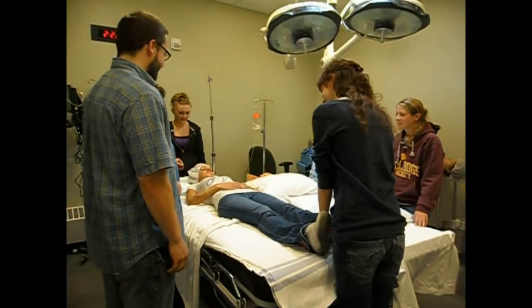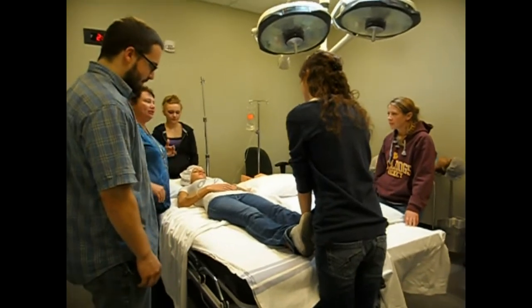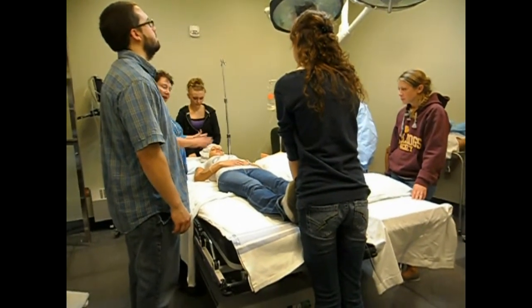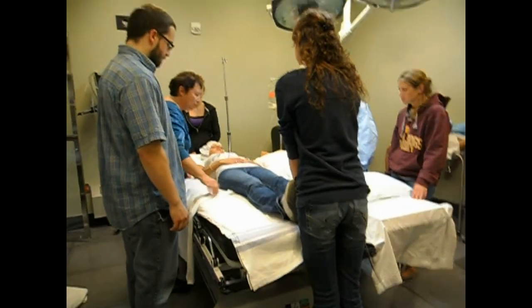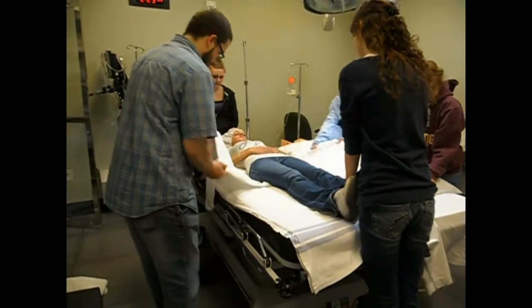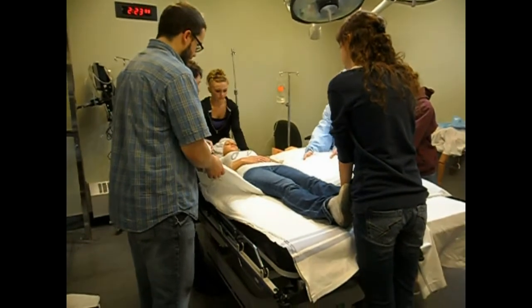And so Randy would have a blood pressure cuff on her and an oxygen saturation and the EKG and whatever. And so then we would put her to sleep and an endotracheal tube would be put down. So the first thing that we want to do is we want to take the draw sheet. You guys are going to take this. And Jeremy and I are going to take this and we're just going to get her to the edge. And Randy's going to watch her shoulders and her head.